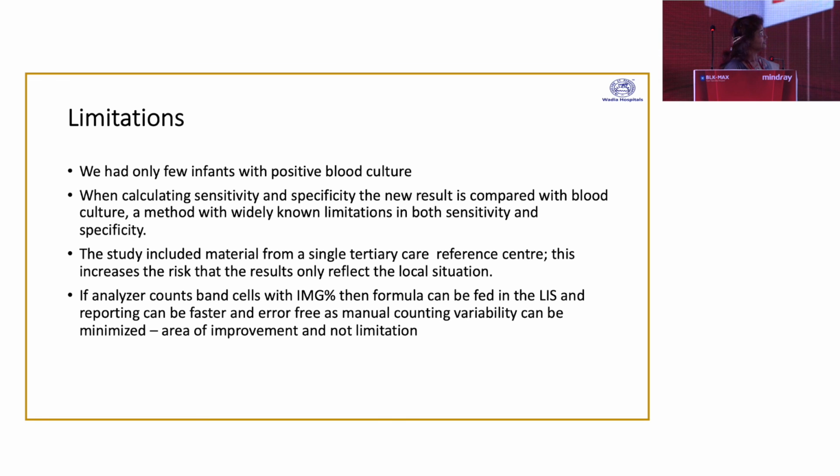When calculating sensitivity and specificity, the new result is compared with the blood culture, a method which has its own limitation for both sensitivity and specificity. The study included material from a single tertiary care reference center. This increases the risk that the result only reflects the local situation.